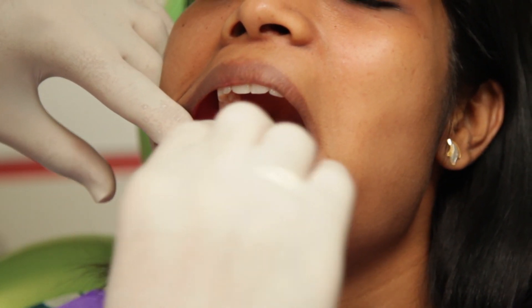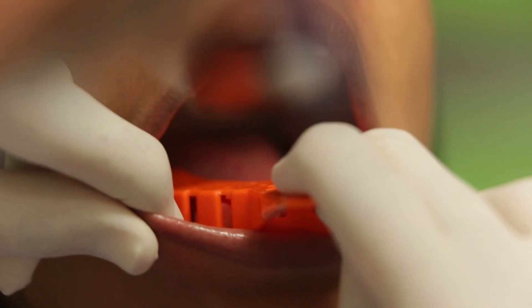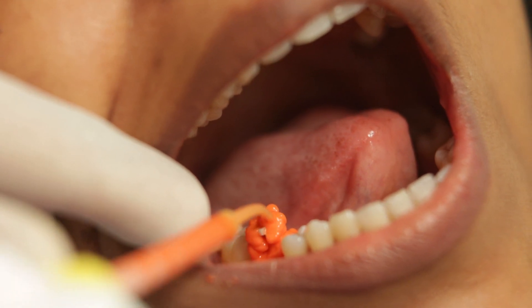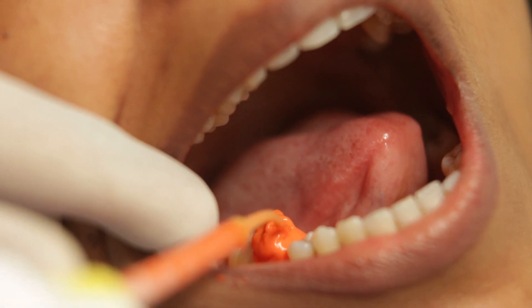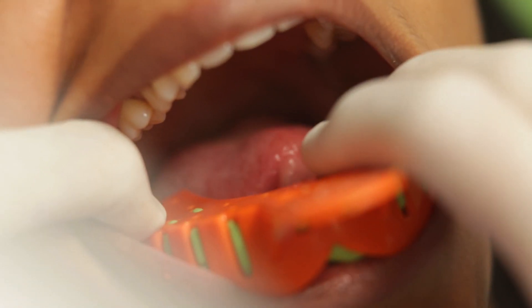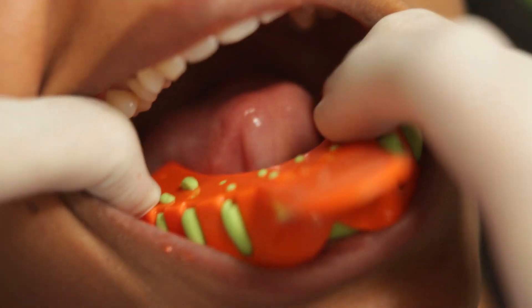Now it's time to take the impression using the usual impression tray. These closed tray impressions are great for single tooth implants and maybe a couple of implants with good parallelism. They are also great for patients who have a limited mouth opening, which makes the open tray impression a little difficult.